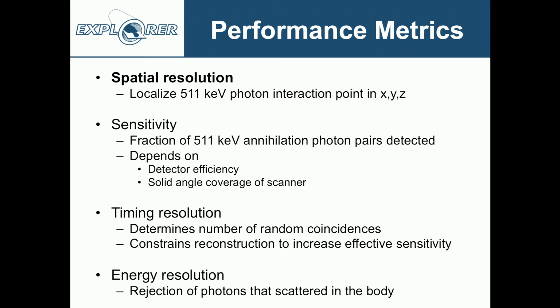Timing resolution is another huge focus in PET right now because it actually plays into the sensitivity. If we can constrain the event using time of flight information, we can get an effective increase in sensitivity that's quite dramatic. And some of the new detector technologies and new scintillator materials that are coming along offer great promise in that regard. And of course, we're also always interested in having good energy resolution, knowing the energy deposited by the event in the detector, because photons that have scattered inside the body will have lost some of their energy, and this provides our primary mechanism to reject scattered radiation.